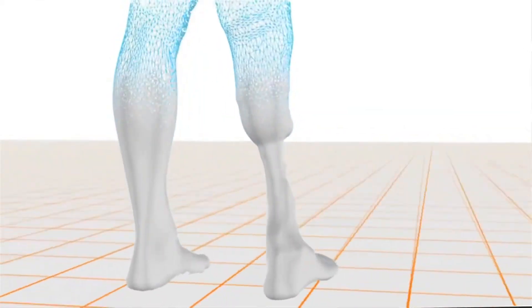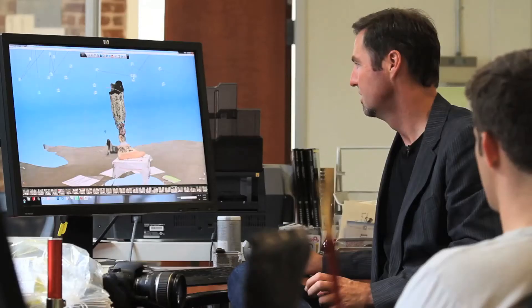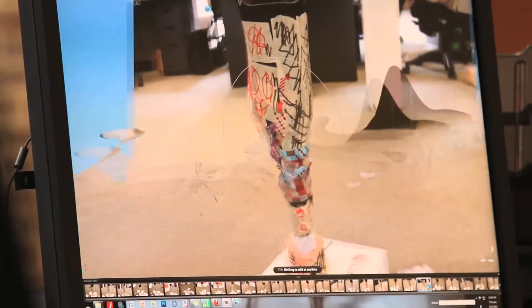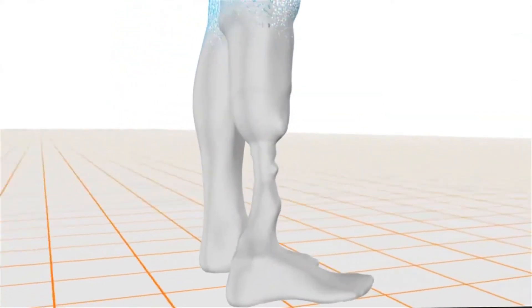But on the flip side, you don't want to have beige rubber pretending to be flesh and blood — it's a false stand-in. We use morphology. We do a three-dimensional scan of their external shape. They take a bunch of pictures and feed it into a computer, and the computer generates a three-dimensional data representation of that three-dimensional object. We scan the hardware and his sound side leg because we need both to recreate symmetry.